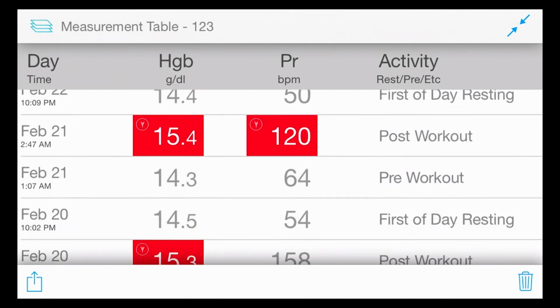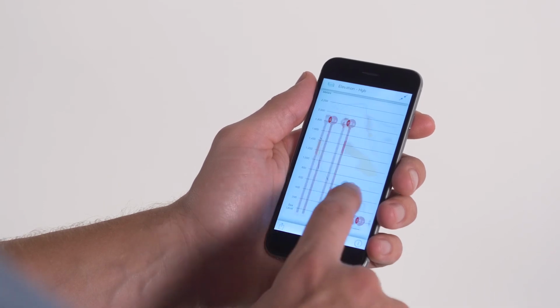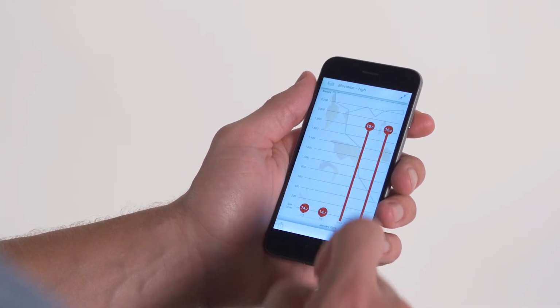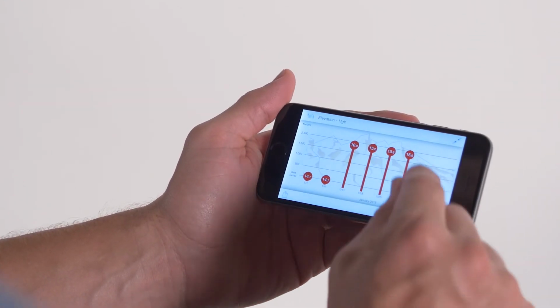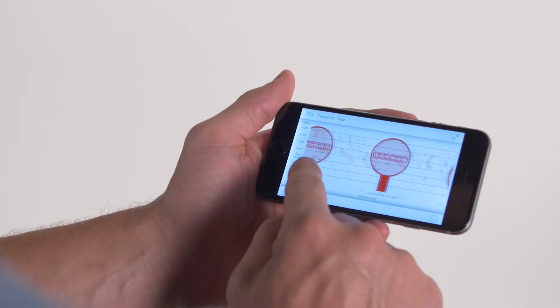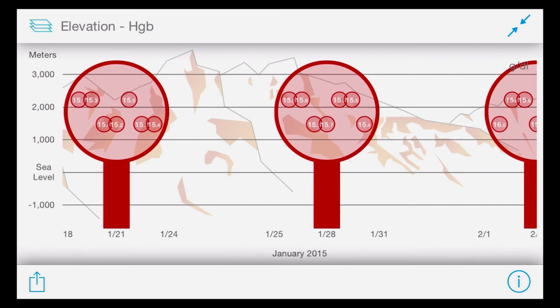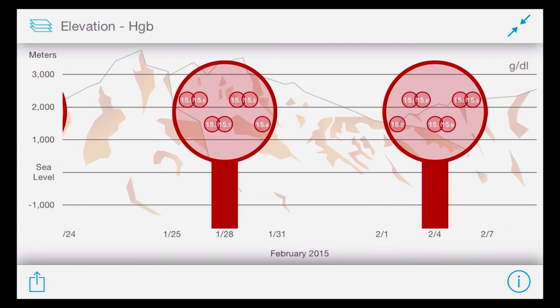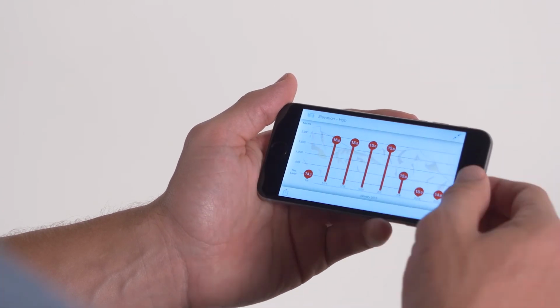Let's take a look at John's elevation history to confirm that the changes that we see in his trend are due to elevation changes. Each bubble represents about 1 week's worth of data averaged together. We see his average is 14.7 grams per deciliter at 200 feet above sea level. Swiping across the screen to the next week bubble, we see his bubbles jump up higher from elevation and his average increased to 15.4 grams per deciliter after 2 weeks at 6,000 feet above sea level.